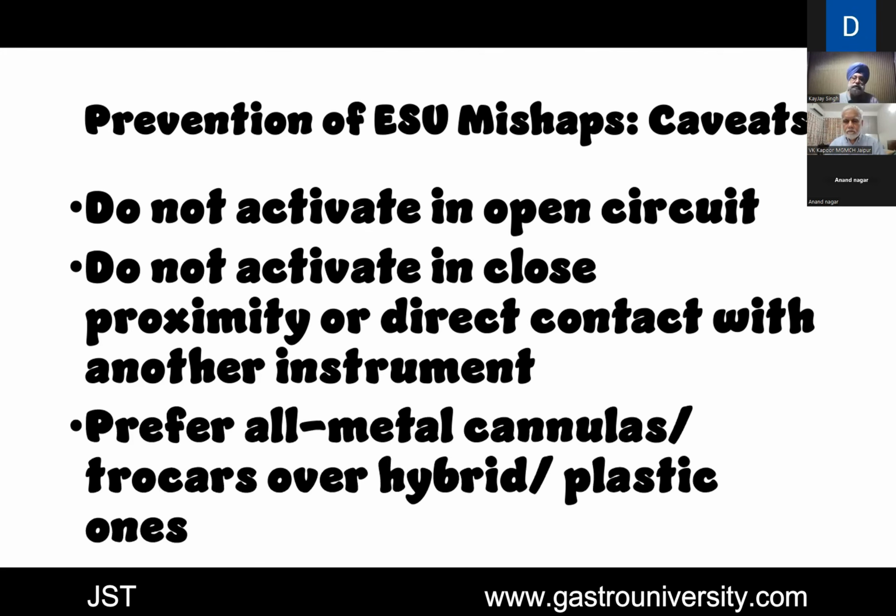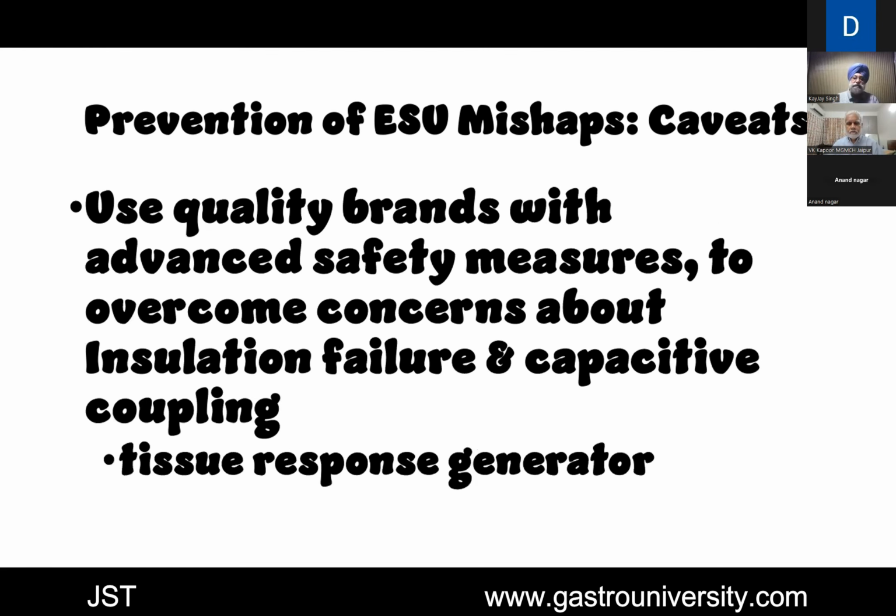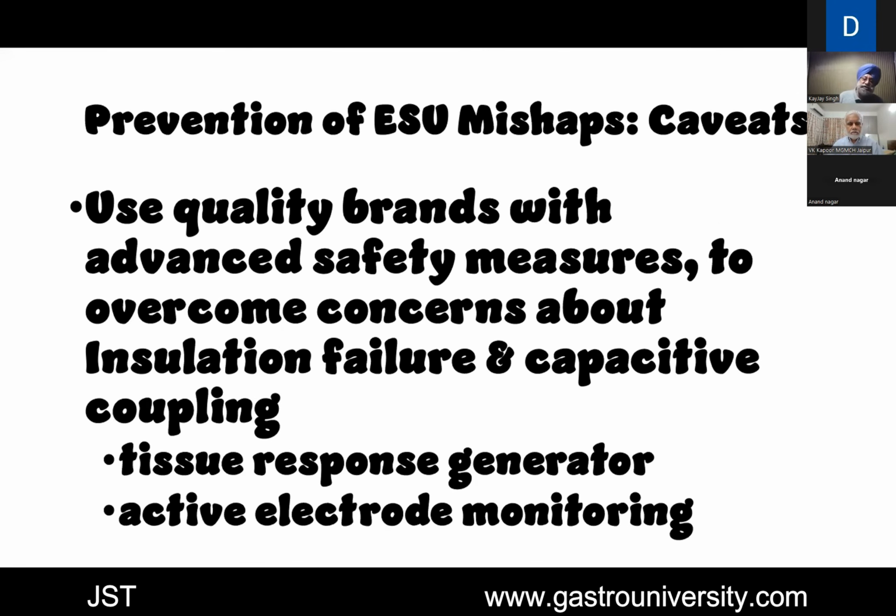Very important. We have certain advances in techniques, and these are tissue response generators and active electrode monitoring systems. They are the systems which sense a leakage of current from the electrosurgical unit, and they give you a warning that there's a leakage. So stop and check your instruments.